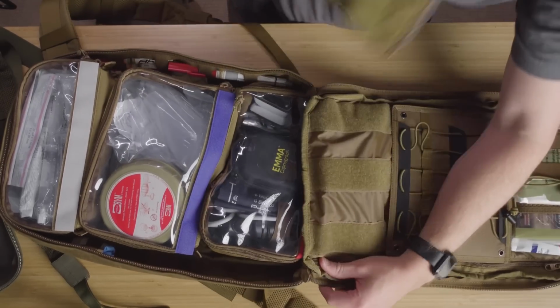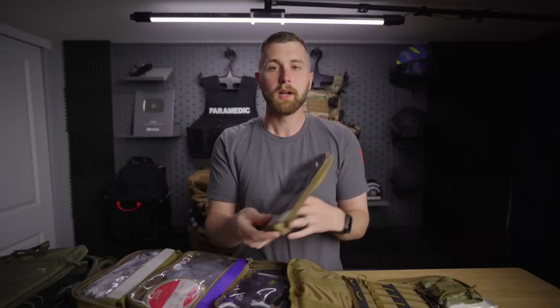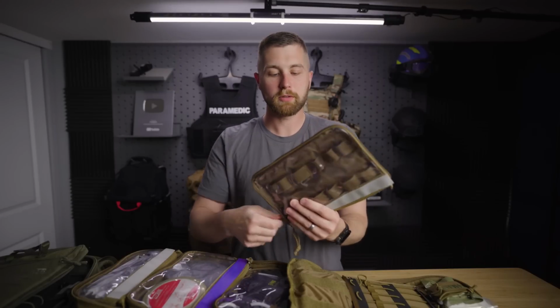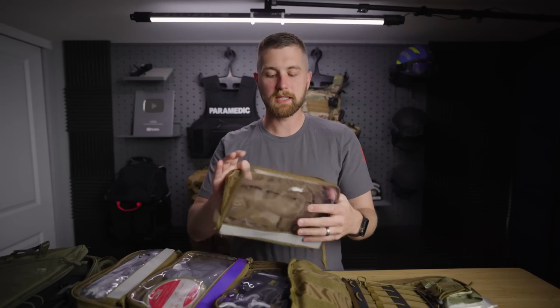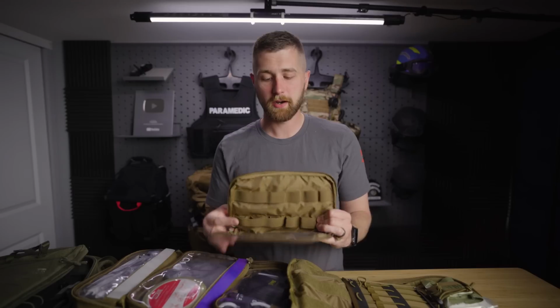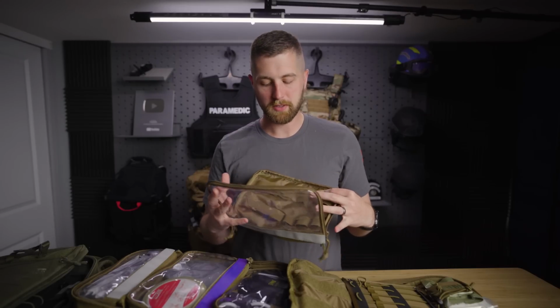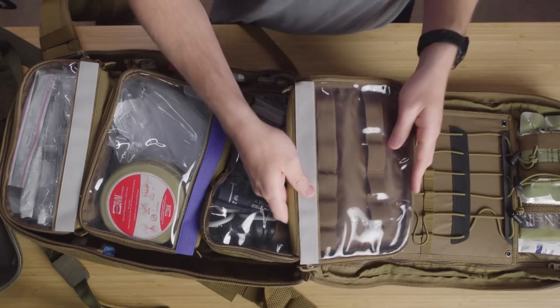This is a mini pouch, so there's no depth to it whatsoever. I personally would rather just have a full panel on this guy, because this doesn't give me that much more functionality. Maybe some IV stuff, I could put like an IO drill in there. It's going to tent out a little bit, but it's going to be just fine. But this is not a very large pocket, and that sits down there.